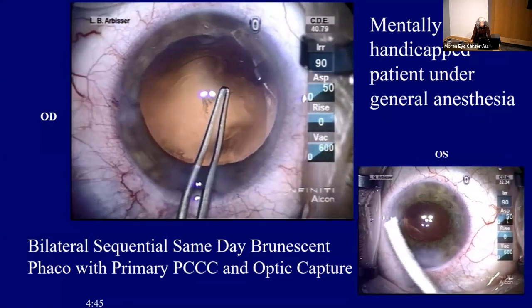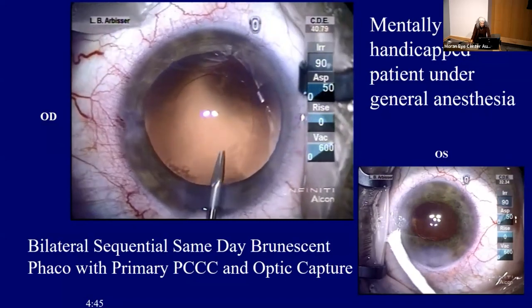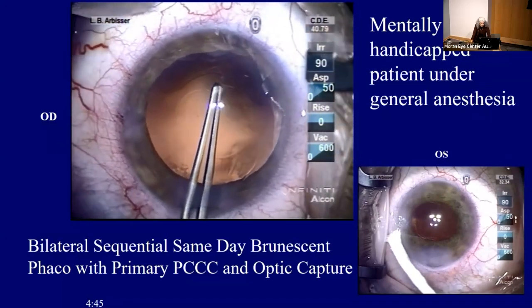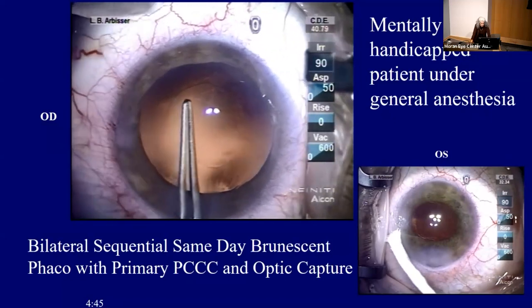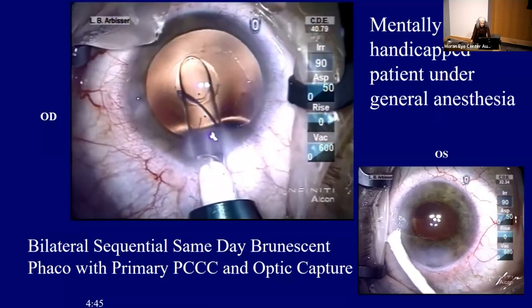Capsule. The anterior capsulotomy. And I made it a little small. I decided I'm just going to gild the lily a bit and make a little opening in that capsule again, make a little tangential cut and make it more perfect. And you can see it's so controllable that one can do that even for that posterior capsule.